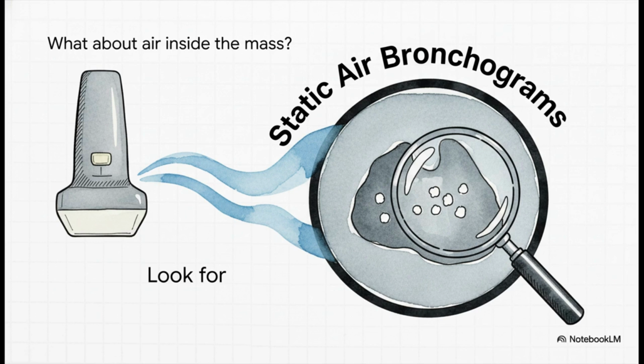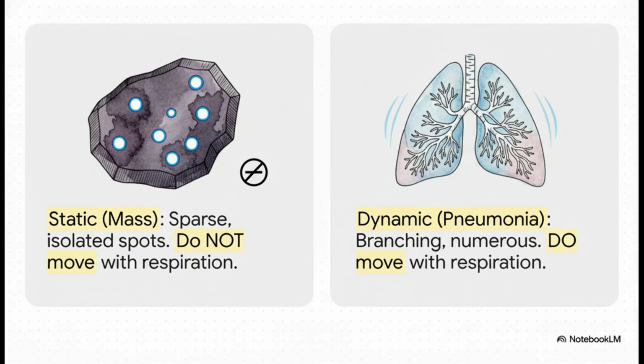And this right here is the whole story. In a tumor, the air is completely trapped and locked within that nasty tissue, so you'll see these few isolated bright spots that are totally static. They don't move at all when the patient breathes. Now, compare that to pneumonia.